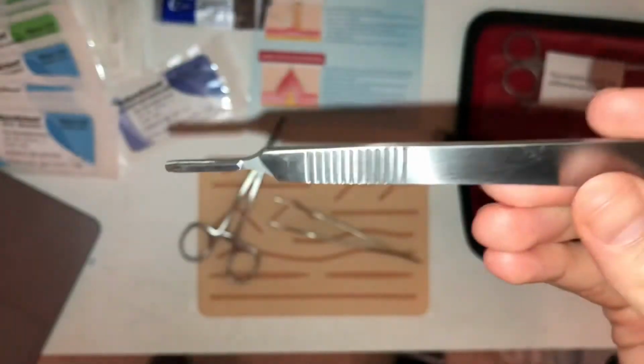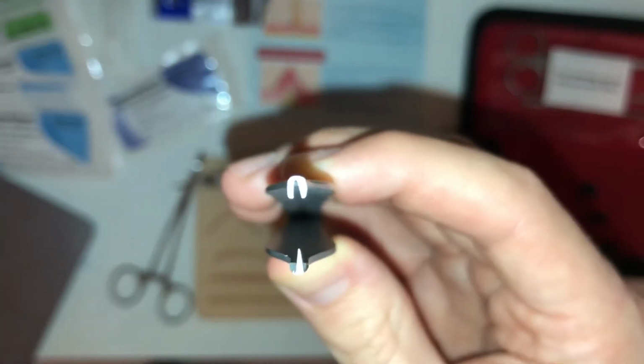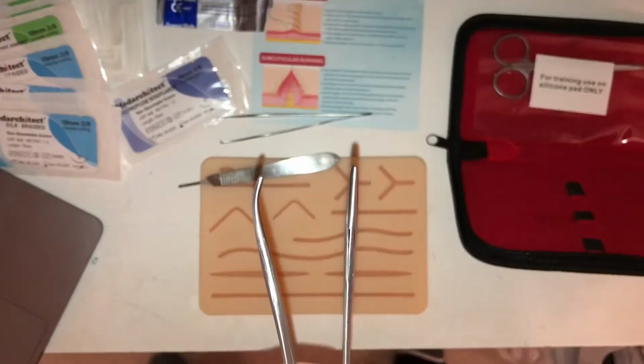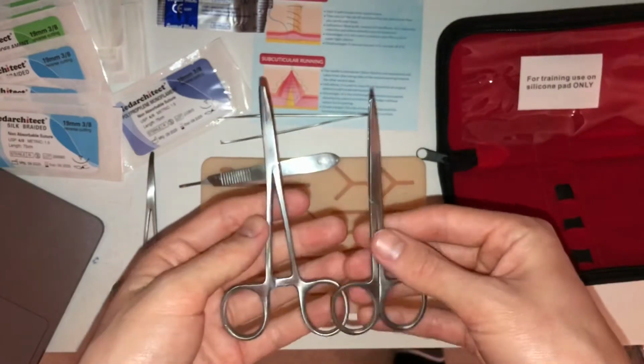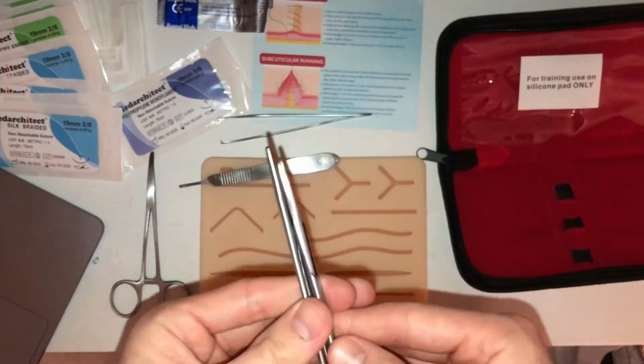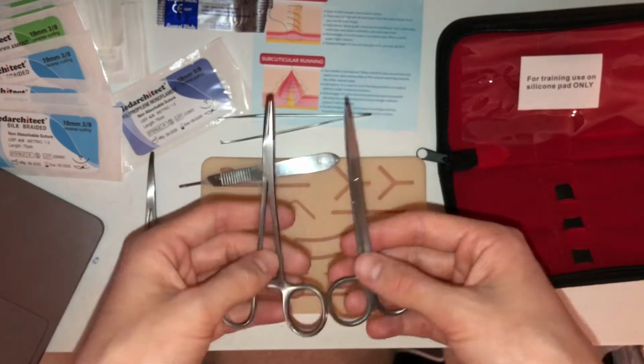There we go. So looking at our different tools here, we've got something a little different. This one I thought would come off if I can get it to focus. It's got a little gap right here, which you can't really pick up, and the needle driver, I believe. Otherwise I don't know. And then this one's got little forceps, and it's got a little pinch to it, so you can see that there. The difference here is this one doesn't look like it's bent at the end. But other than that, it looks pretty similar. And the difference between these is obviously size. You can tell, even comparing next to each other, that they're very different in length. But yeah, they're both pretty similar.